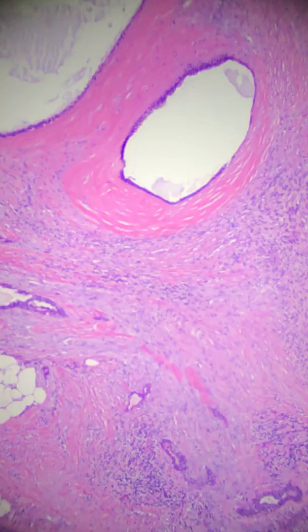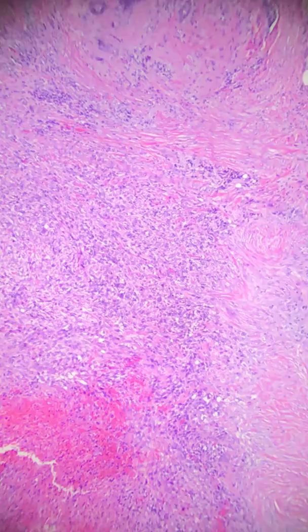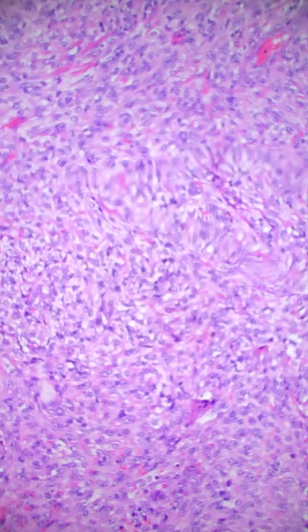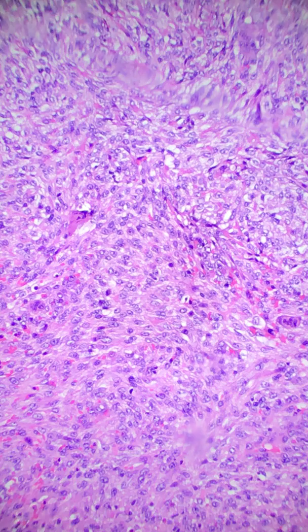In the sections received on this tumor, I did not appreciate full-blown DCIS. There was maybe one focus of ADH. So I wouldn't necessarily go that way on this tumor, but I think there's enough morphology to at least get you thinking, hey, am I looking at a metaplastic lesion? So here maybe a little more pleomorphism.